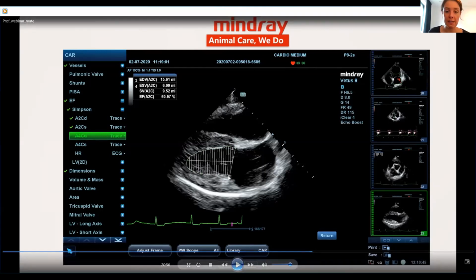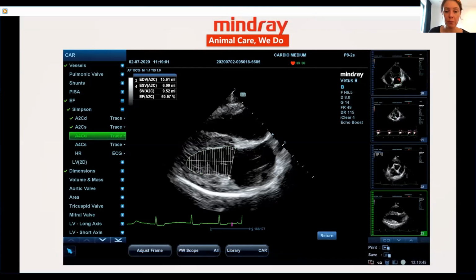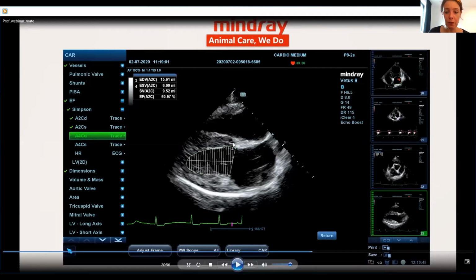So there's basically 3 points that are very important. Point 1, don't go too far. Don't go actually beyond the mitral valve annulus. So you orient here on the mitral valve annulus. Second point, you need a long ventricle. Third point, you need good delineation of your endocardium. And with that, I also mean that in systole, you will have to probably cut out the papillary muscle.